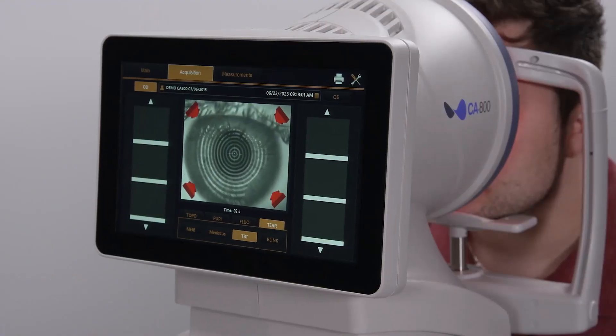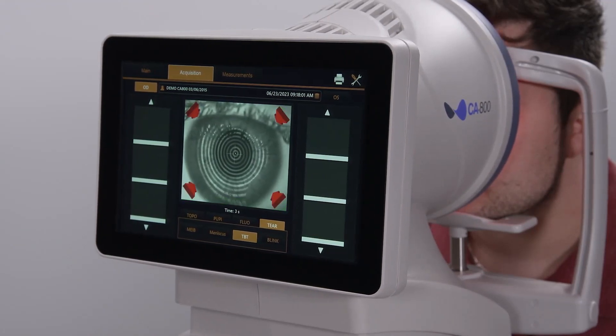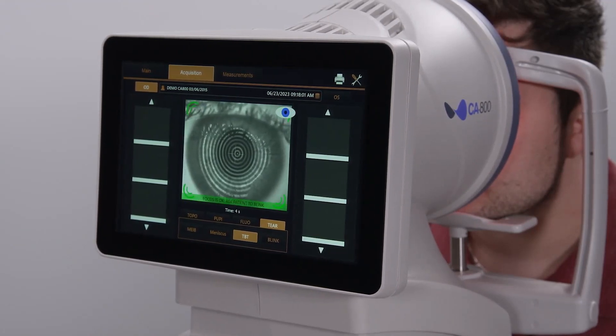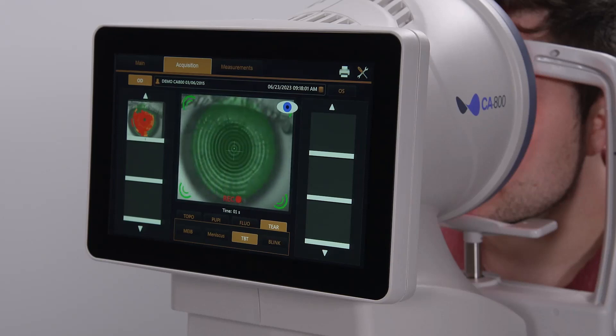Red arrows indicate to move in and the blue arrows tell you to move out. When optimally aligned, green markers will appear along with an on-screen notification to ask the patient to perform a big blink and then hold their eyes open for as long as they can. When the blink is detected, this automatically starts acquisition, which continues until the patient blinks a second time.